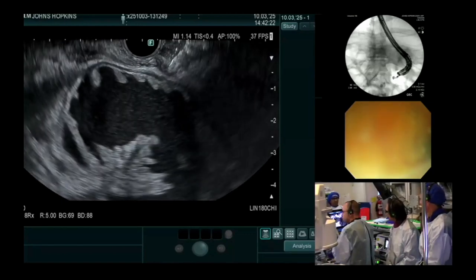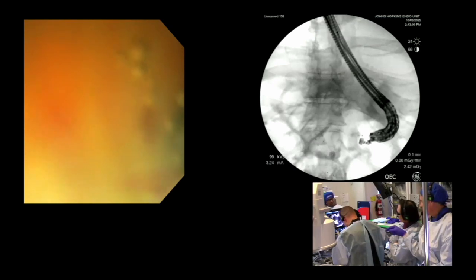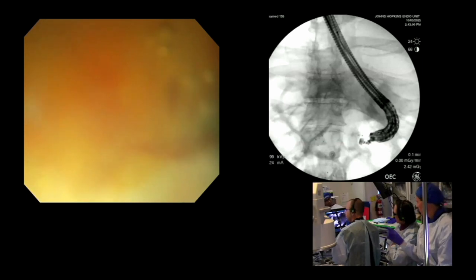I think also in terms of the direction of your stent placement, this is a better position now. So, fluoro, let's see fluoro. Burning the stent through the wall, he will have plenty of space in front of him, so he would like to have the jejunum here in the longitudinal axis, which is the case right now. And the second reason is that this is used to treat afferent loop syndrome, but if you have to go through the stent and perform ERCP, you would like to place the stent towards the biliary enteric anastomosis, which is the case here now.